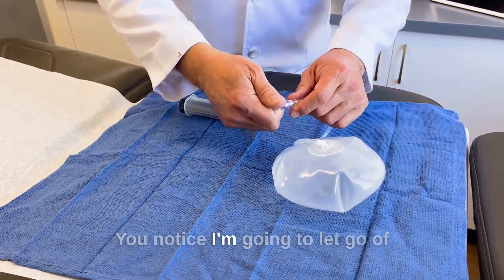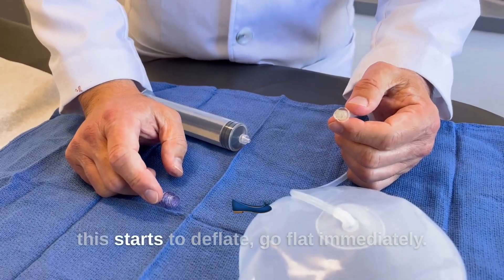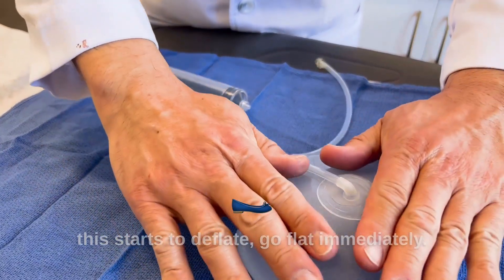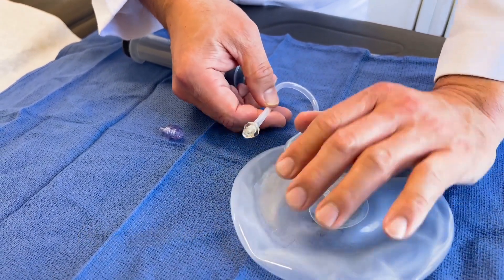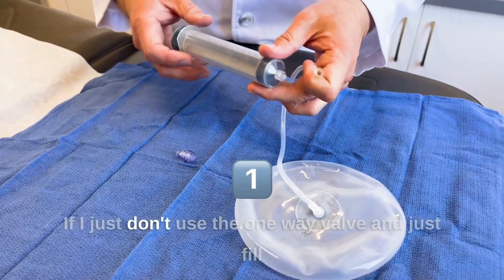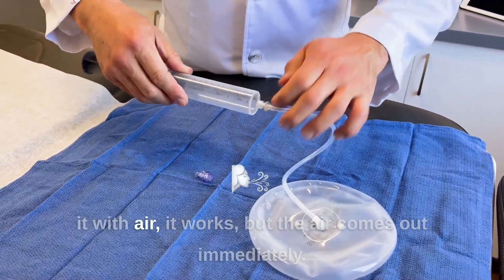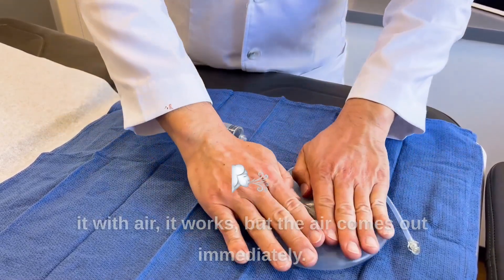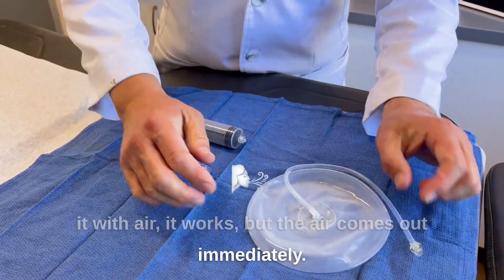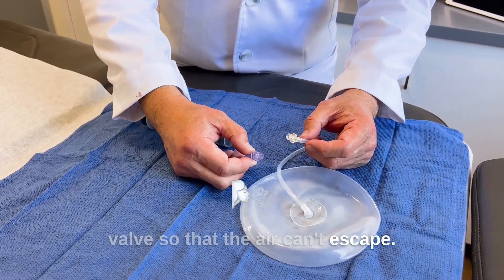You notice I'm going to let go of this — it starts to deflate, goes flat immediately. If I just don't use the one-way valve and just fill it with air, it works, but the air comes out immediately. You have to have the one-way valve so that the air can't escape.